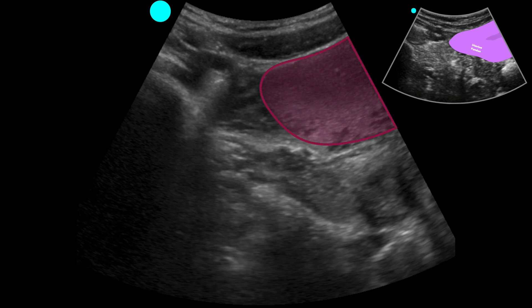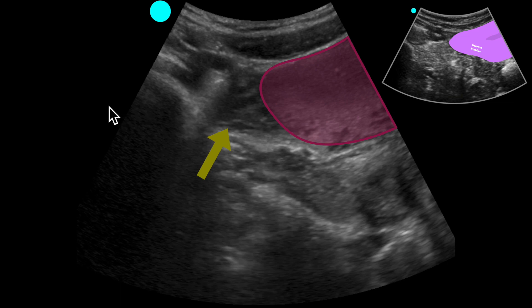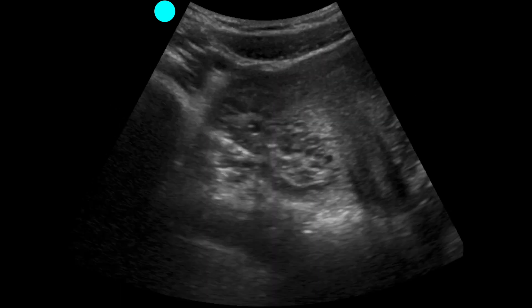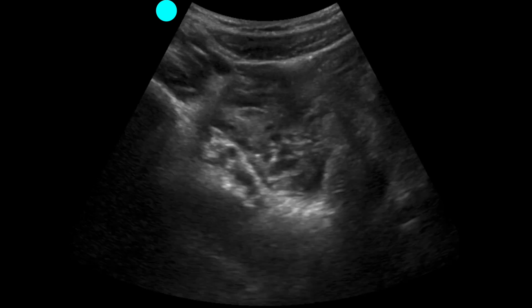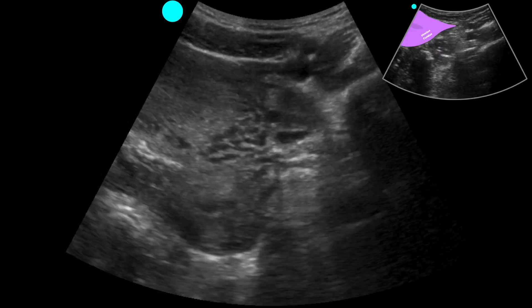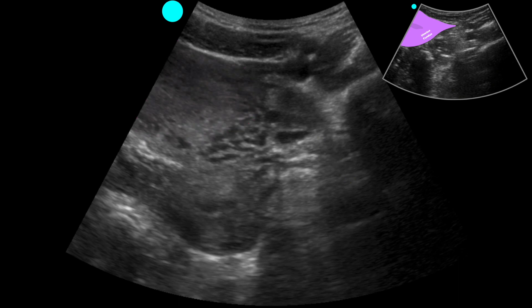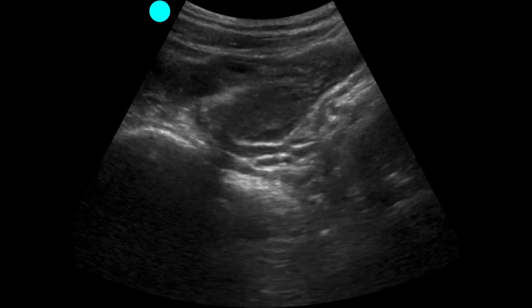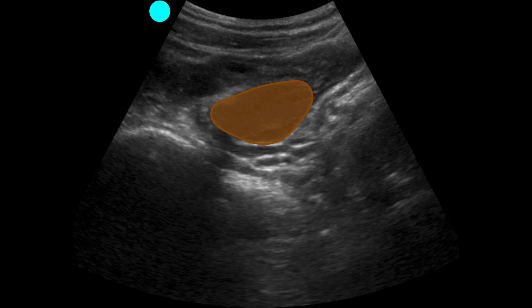We push our attention toward the right adnexa, keeping the uterus in plane as a reference. We can see the iliac vessels and the pelvic brim, which serve as our lateral border. Our focus is on everything between these structures and the uterus. Scanning through here we don't see any obvious adnexal masses or cysts. We drag toward the patient's left to look at the left adnexa, where we identify a structure with the right location and echo texture for a possible ovary.